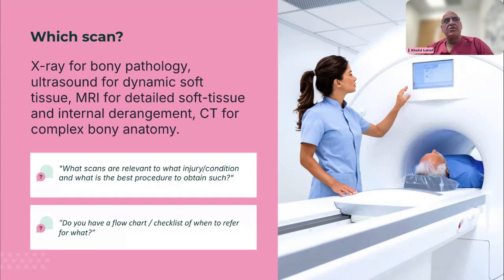If, for example, the patient's had trauma and let's say they've had a spinal injury, you might do an X-ray, but an X-ray may not pick up the subtle fractures that you sometimes see in trauma. I do a lot of trauma work in the Queen's Medical Center. Pretty much the current trauma guidelines are that everybody has to have a whole body CT scan, which would include the spine as well.